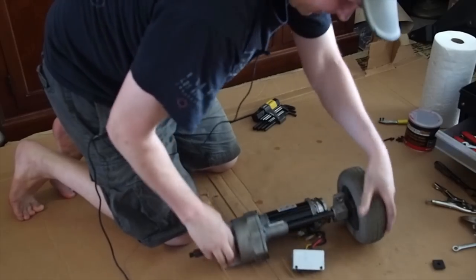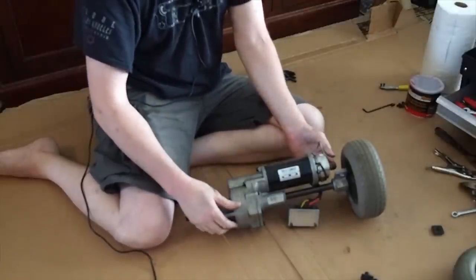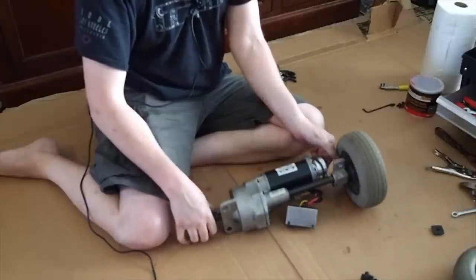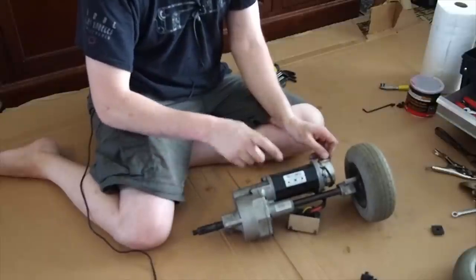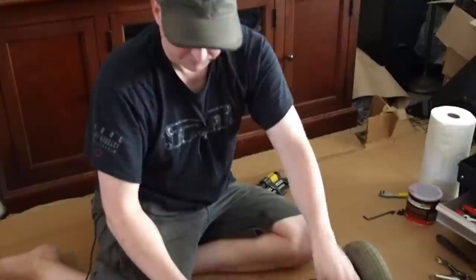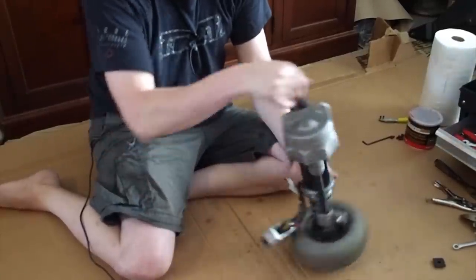And as you can see here, here's the transaxle and here's the motor. I've tried to find a replacement motor for this because I thought it would be fun to go a little bit more powerful. We've got a bigger battery, why not a bigger motor? However, I couldn't find anything that would work. I couldn't even find a replacement for this. I know that they've got to exist. There's some company that's making these that are reselling them to GoGo. I want the same motor, and I should be able to just find it, but I haven't been able to find it. So if you know where to find it, let me know, and I'll probably buy one. Although I really kind of want something that's a little more high energy than that.